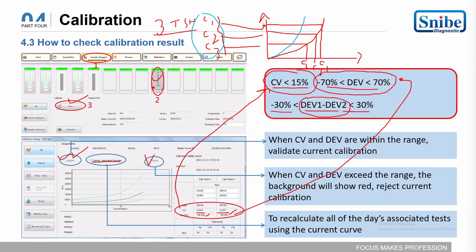In this situation, this is the result for the first tube using the new calibration curve. It will use the same RLU obtained by the previous testing. The RLU is not impacted by the calibration curve, so the RLU are correct for the samples. Just the calibration curve is changing.